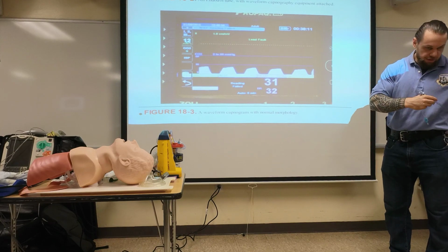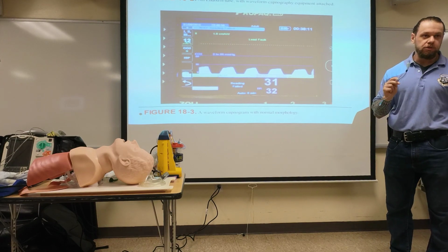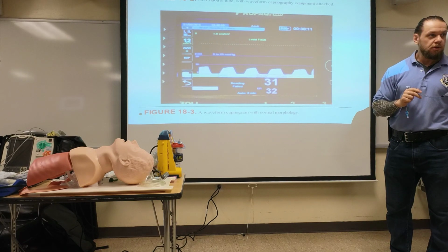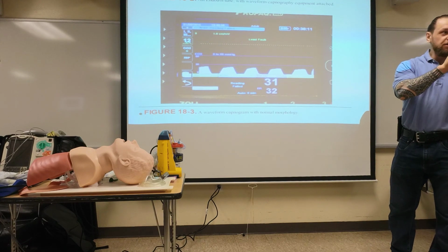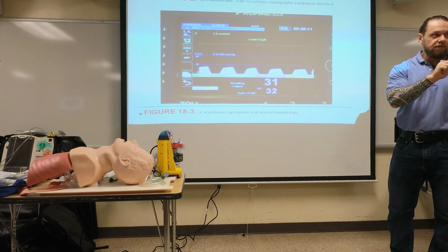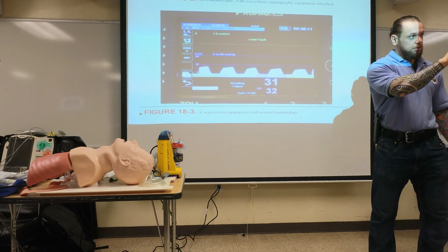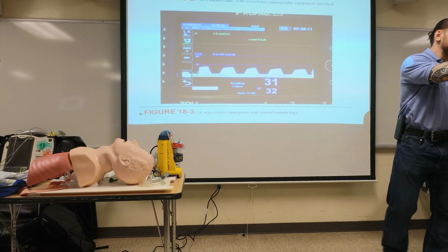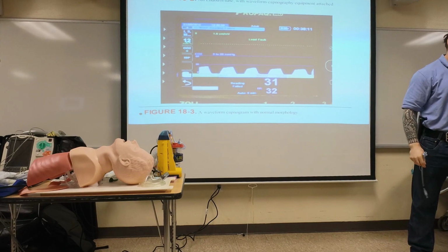I auscultate right and left. Why do I need lung sounds? Make sure you're in the right space. Into the lungs and out to the stomach? That is not the answer. Why? Because I saw it go through the vocal cords. I will never listen to the belly sounds, to confirm that you didn't go farther down. Excellent. Say it louder. To confirm that you didn't go further down.